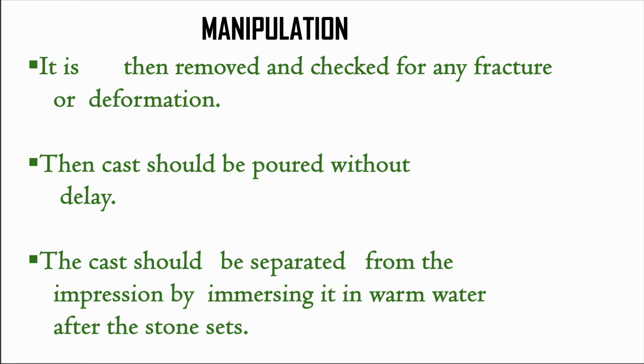It is then removed and checked for any fracture or deformation. Then the cast should be poured without any delay. The cast should be separated from the impression by immersing it in warm water after the stone sets.